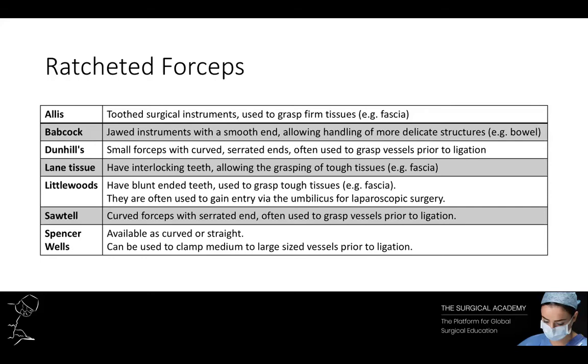Tissue forceps may be ratcheted or non-ratcheted. There are seven common types of ratcheted forceps: Allis forceps, which are toothed surgical instruments; Babcock forceps, which are jawed surgical instruments with a smooth end; Dunhill forceps, which are small forceps with curved serrated ends; Lane tissue forceps; Littlewood forceps; Sawtelle forceps; and Spencer Wells forceps. I'm going to show you an example of each of these.